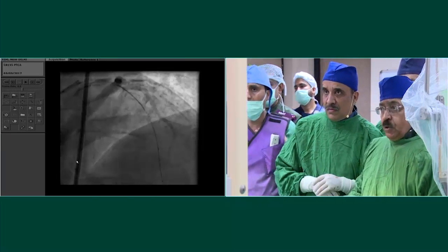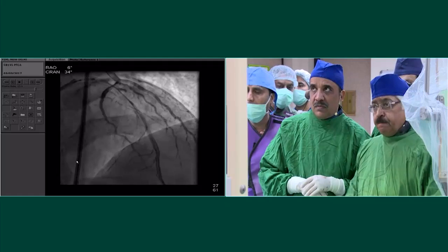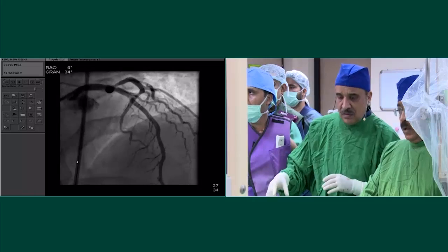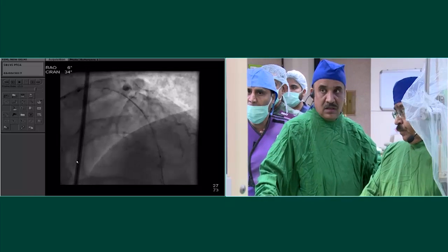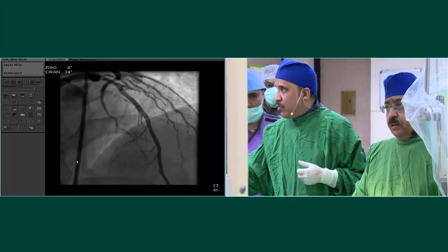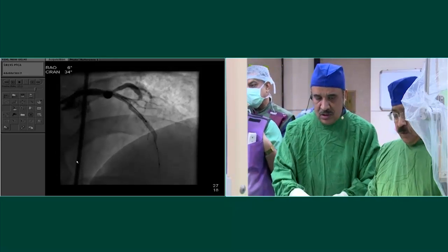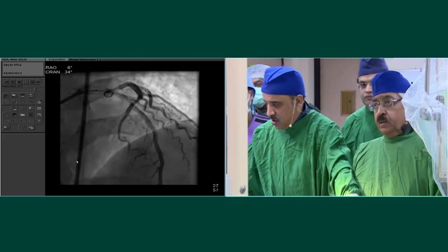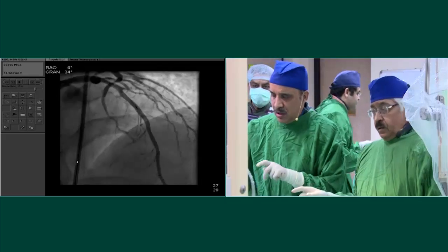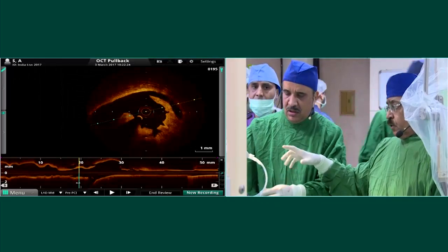Oh, and also I want to show you that the diagonal is disappearing. You switch to the OCT. We see the OCT. Okay. So while you look at the OCT, I'm actually going to wire the diagonal. Okay, can I have the diagonal? Another BMW? It would be interesting to see in the meantime the OCT too. Or are you doing an integration there? An overlay? Yeah, can we show you the OCT? Thank you.